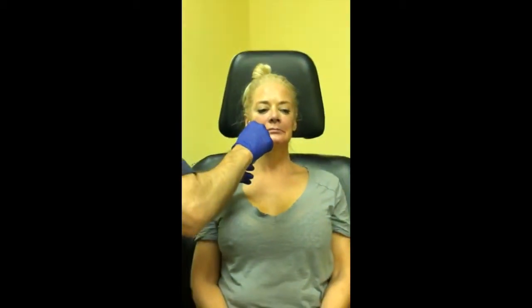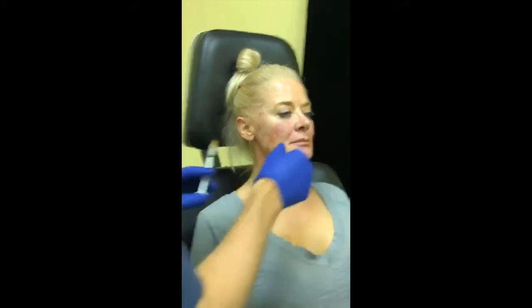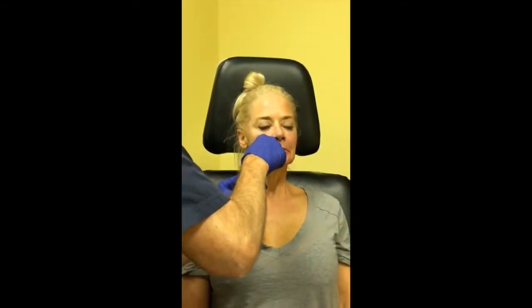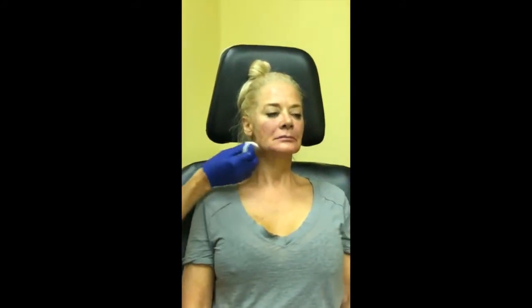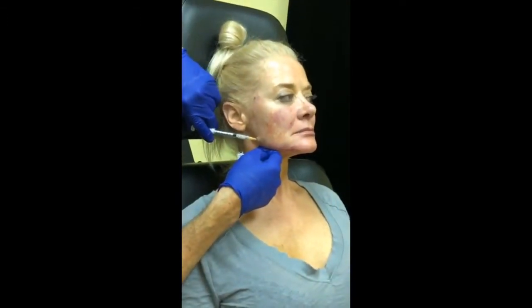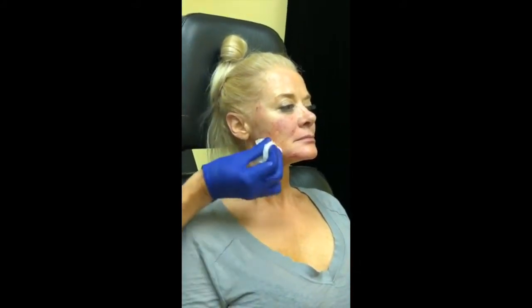I'm going to do a little bit basically behind the jowl as well — we're going to hide that a little bit. She has a good jawline so we won't put in very much, but with some people you can really sharpen the jawline with Belafill. Just a little bit there, and combined with that little bit in front of the jaw, we've basically hidden the jowl. This is the kind of effect you used to have to do a facelift to achieve.